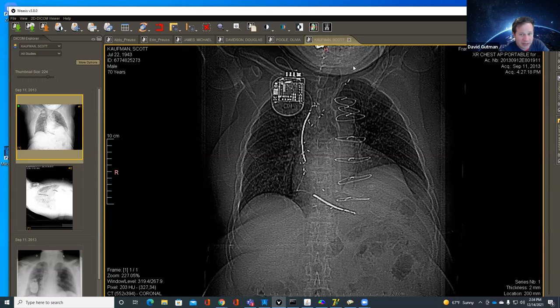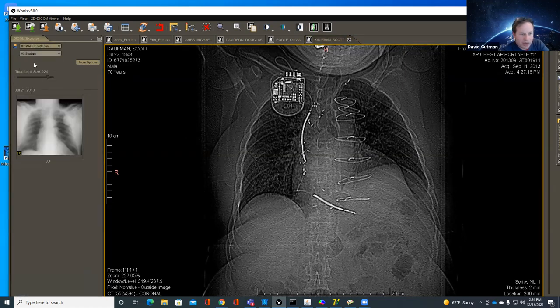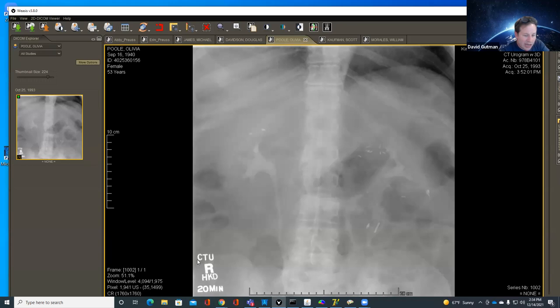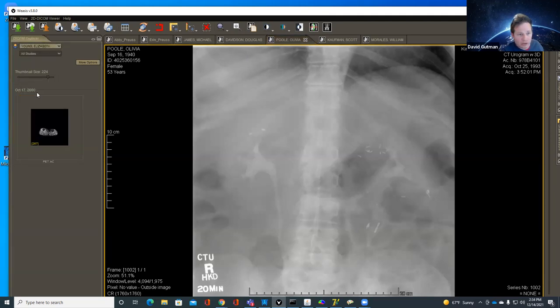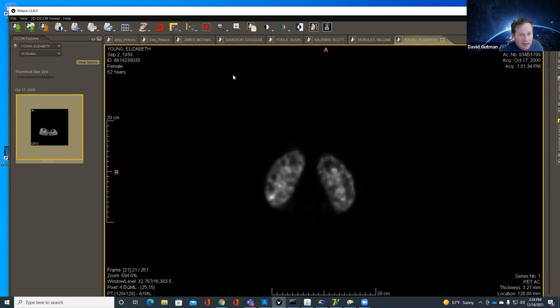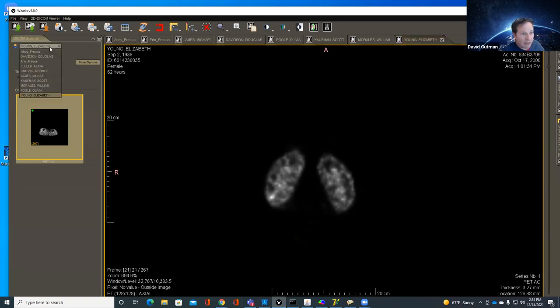Since this is an X-ray or CT, the person might be wearing jewelry with their name written on it. There can be little plates that are part of an X-ray — sometimes the scanner actually just writes the patient information directly on the image: name, birthday, hospital. This is why I'm using the DICOM Cleaner tool, because it not only allows you to scan the metadata, it allows you to block out or black out a region of the images.